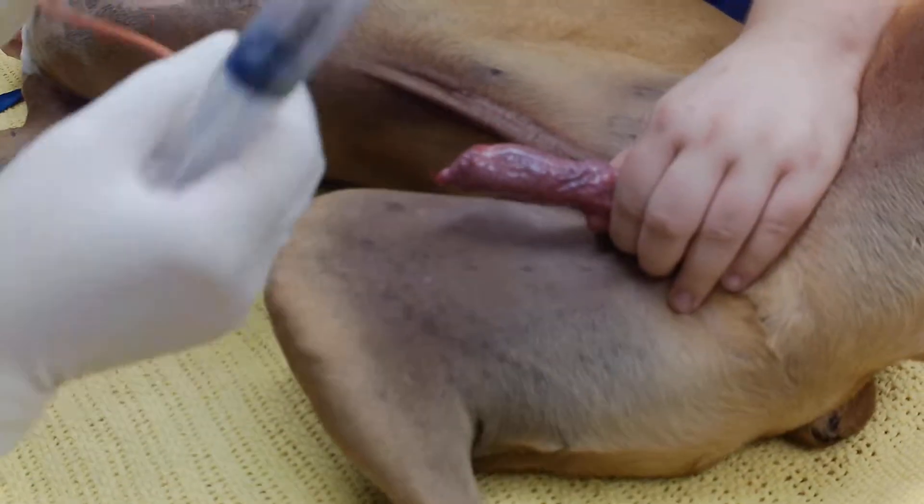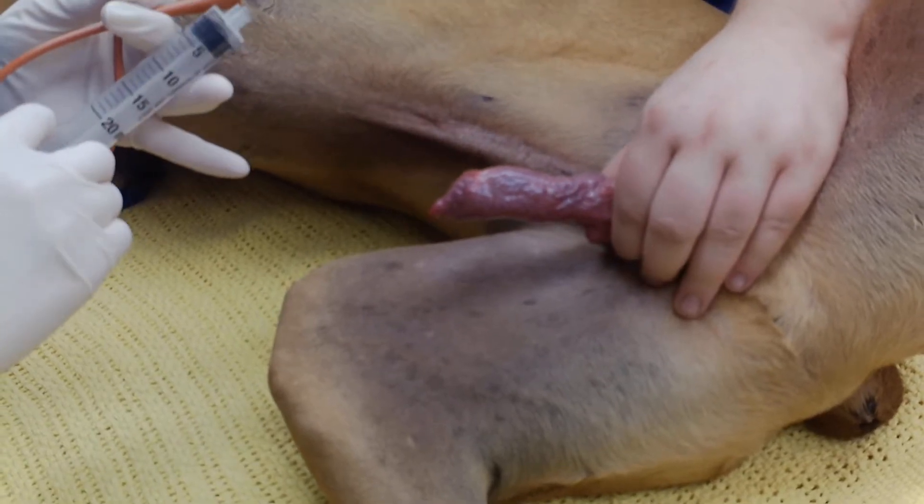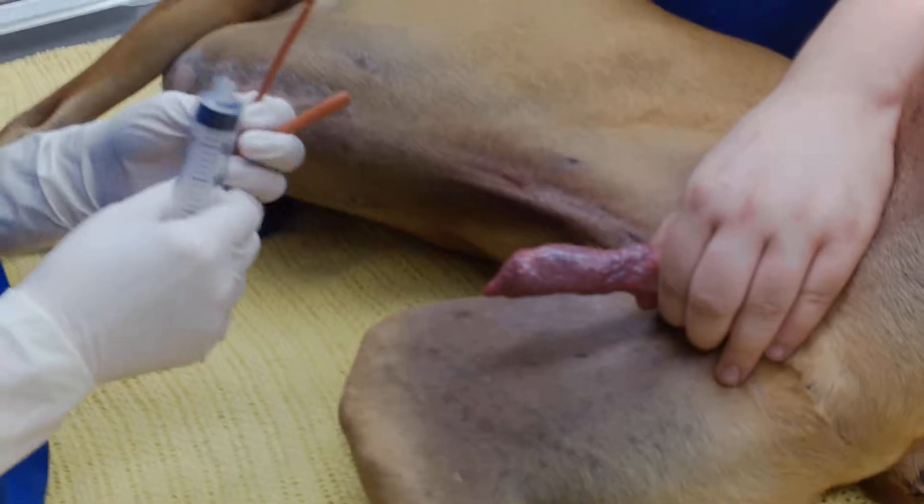You could keep this in to hospitalize him, though it's not ideal because male dogs don't usually tolerate hospitalized catheters well.